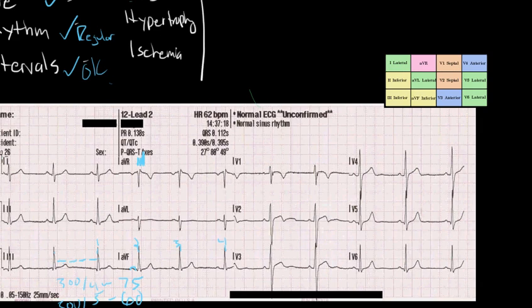Axises are pretty simple. I look at leads one and leads two. Now, in these leads, the R wave is whenever this QRS complex is going up and the S wave is when it's going down. Now if the S wave is greater than the R wave, then the QRS complex is negative. If that happens in lead one, if your S is greater than R, that's a sign of right axis deviation, RAD.